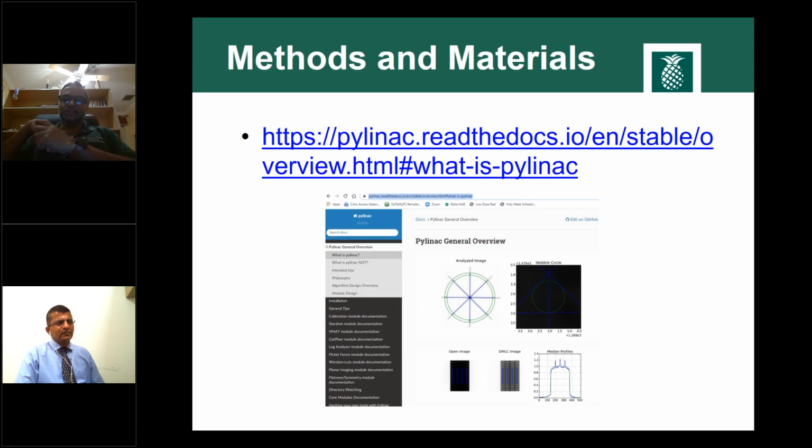And during the lunch time between 12 o'clock and 12:30, maybe 12:45, the physics, dosimetry, and physicians will come together and evaluate all the approved plans for that day, which are going to be used for treatment the next day or so. So the planner will present it, and everybody is going to look into the details of it, and that is where we evaluate our contour also. Before the planner actually puts together the plan, the contour is reviewed. The physicians or the physicist or the dosimetrist, whoever did the contour, will have to defend their work, and the others do peer evaluation. That's the clinical thing on a daily basis.